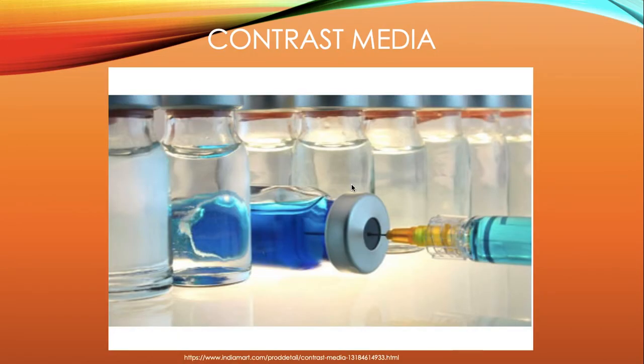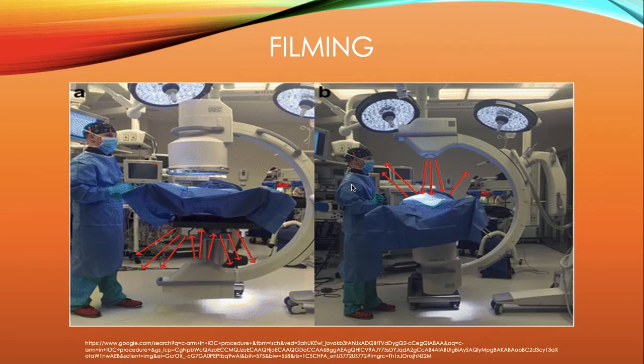So contrast media, like I said, is used during this examination, but the amount and the type of contrast used is dependent on each site and also the surgeon. The purpose of contrast media is to help visualize if there is any blockage within the ducts, and this could indicate if a stone is present.